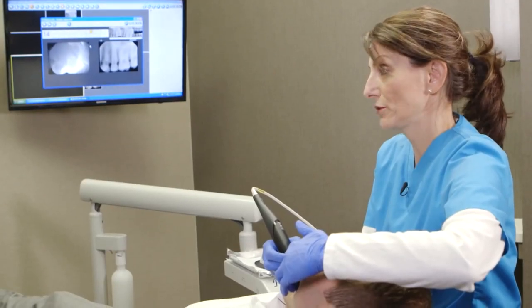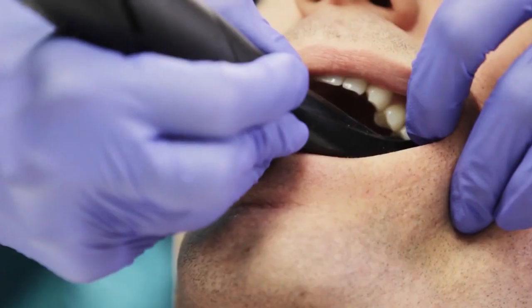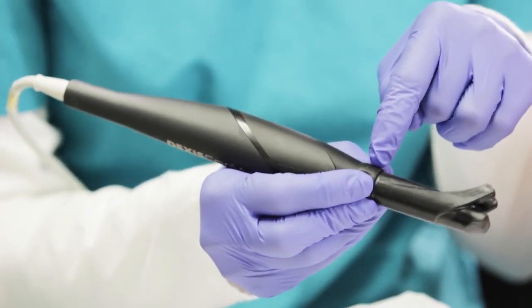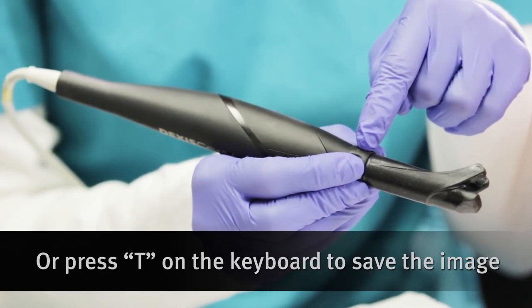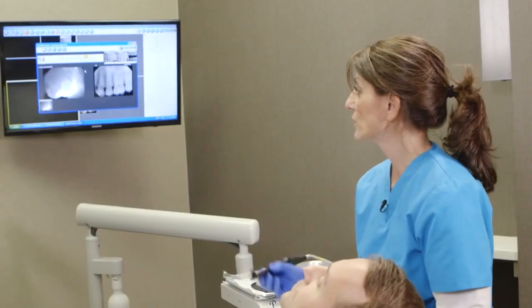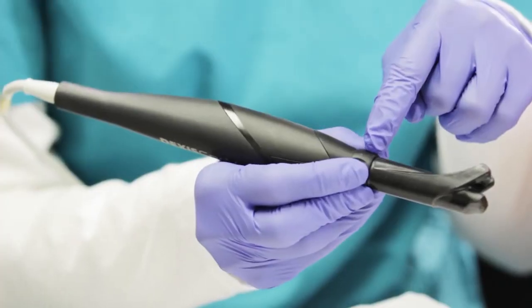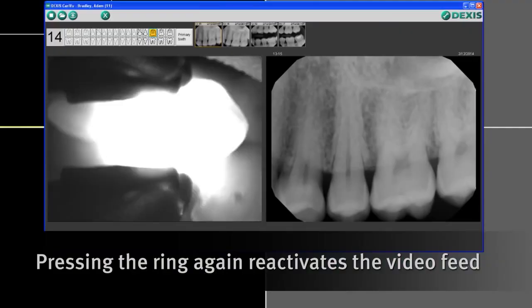I'm going to capture the image by squeezing the ring. To save the image you would just squeeze the ring for three seconds. Once the image is at the bottom of the screen, you know that you've saved the image. Squeeze the ring again and go to another tooth.